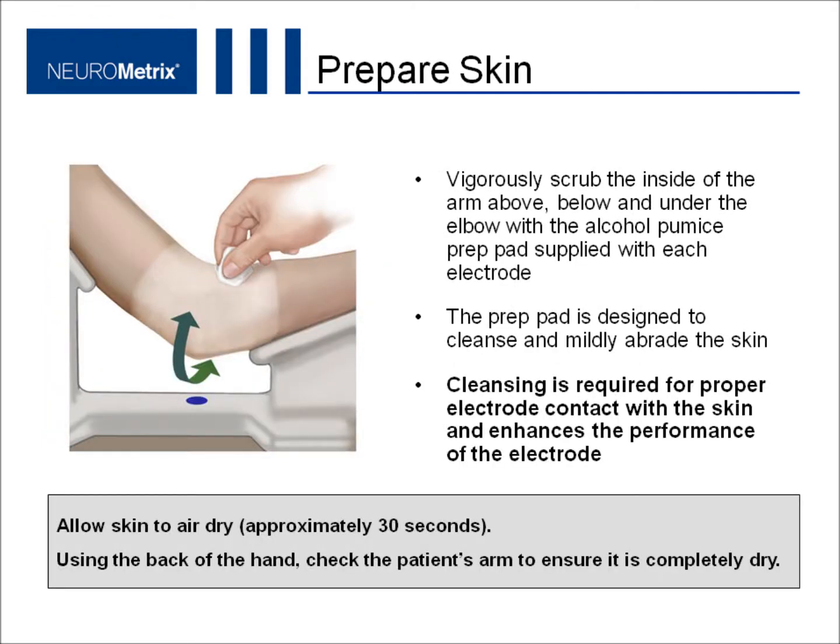To prepare the patient's skin, vigorously scrub the inside of the arm above, below, and under the elbow with the alcohol pumice prep pad supplied with each electrode. The prep pad is designed to cleanse and mildly abrade the skin. Cleansing is required for proper electrode contact with the skin and enhances the performance of the electrode. Allow skin to air dry for about 30 seconds.